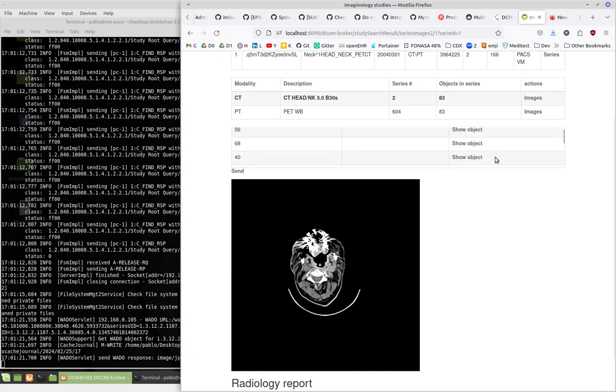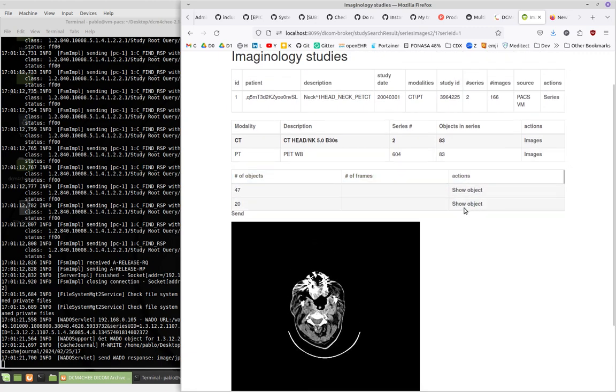No, this is scrolling. No, it's not multi-frame, it's single frame, but this table has a scroll here. I need to make this scroll bigger or this table bigger. So if I go, and the objects are not sorted, so I will need to sort this out.